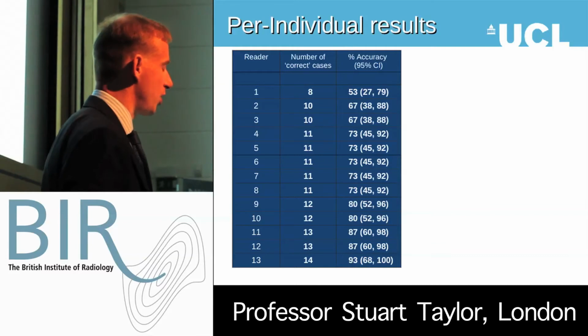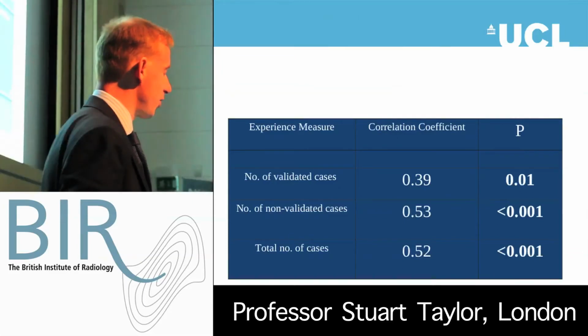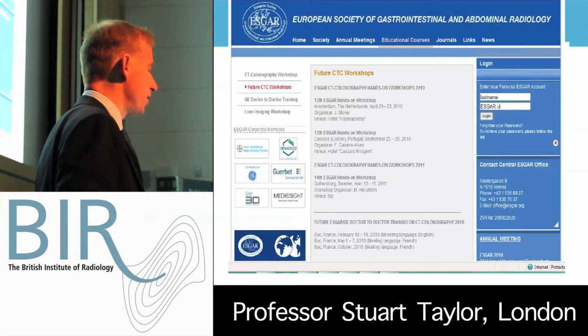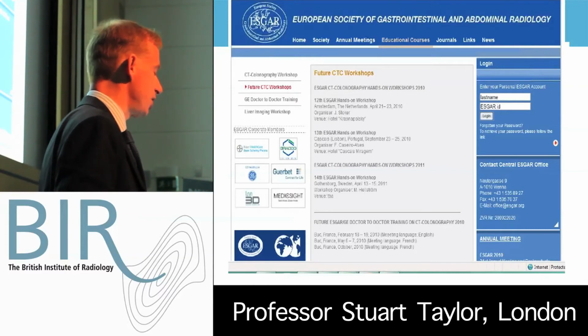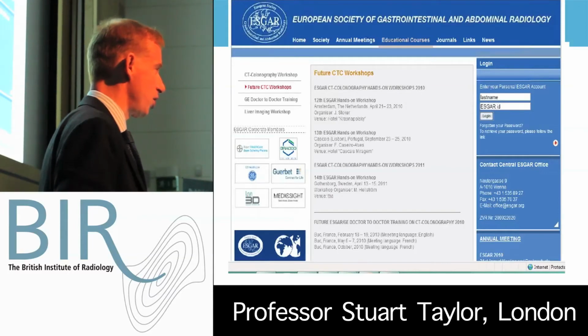weren't. So we can't assume that CT colonography is an easier test in total than barium enema, because we do have to train ourselves to do it properly, and there's a large potential for making errors. And again, the more cases you've done, the better you are. So therefore, that's why with CT colonography, there's definitely been an industry in hands-on workshops, and the European Society have done lots of hands-on workshops. If you fancy a trip to a nice European city, this is quite a good way of getting your training. There's also UK ones in, I think, Leeds, St Mark's as well. But a lot of radiologists have gone through these training workshops, and basically you can sit down and do your 50 cases in a controlled environment and get yourself up the learning curve.